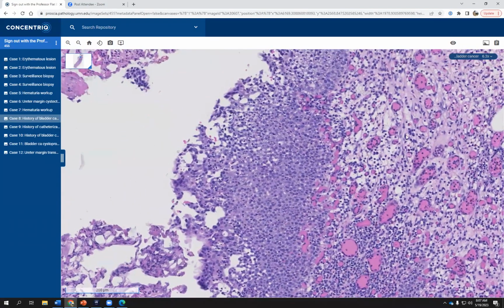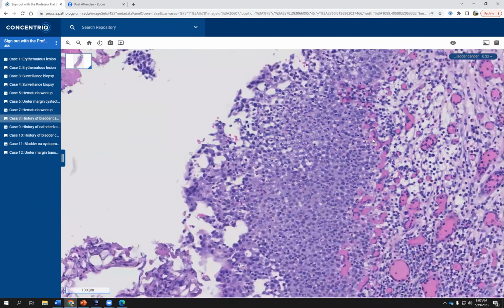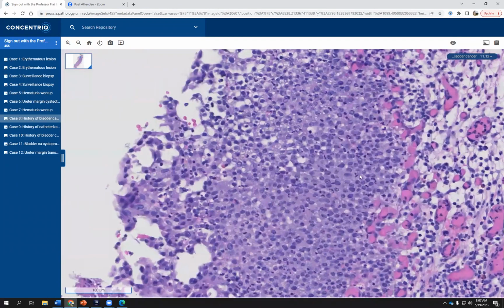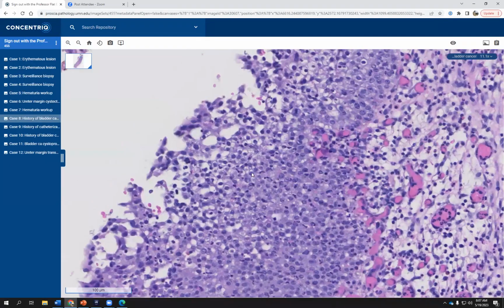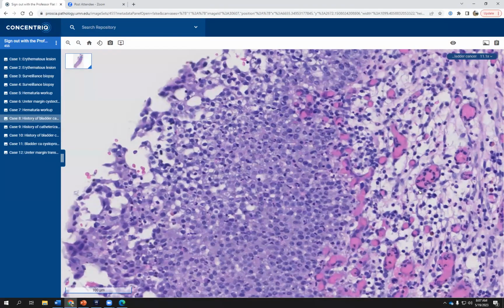not only is confined to the stroma, but also infiltrates into the overlying urothelium. So you can clearly see the neutrophils infiltrating the urothelium over here. So whenever we have that, this can induce a reactive change in the urothelial cells, which can cause enlargement of the nuclei, which can cause prominence of the nucleoli, which can cause some nuclear overlap, which can increase the mitotic activity, and which can also be responsible for the surface denudation. So in these situations, your threshold for making the diagnosis of carcinoma in situ has to be much higher than normal.